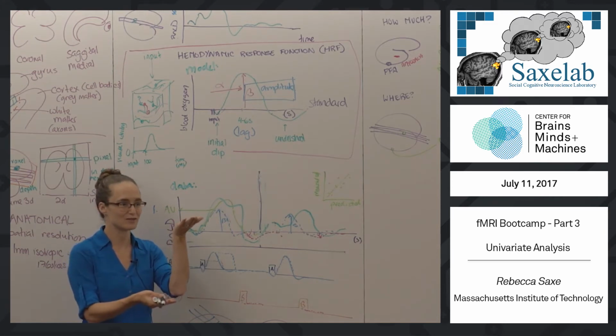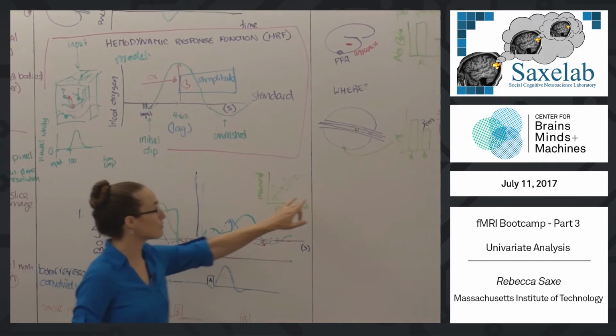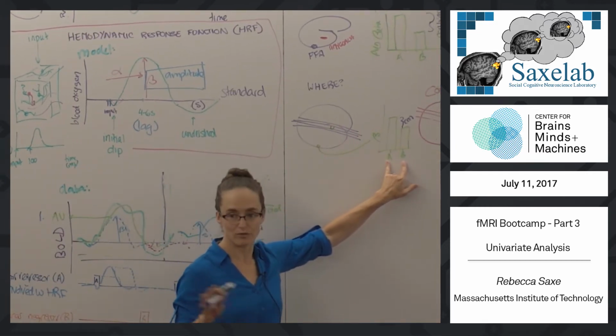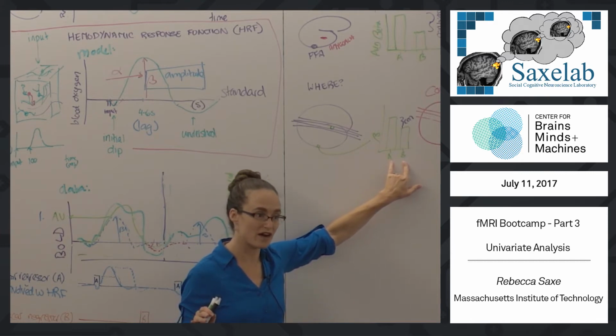The signal, the difference between conditions, how big is that relative to the noise in the thing I measured it in? And so now here, what we want to know is, we don't have any other participants. This is one person. We have one voxel, the beta for A, the beta for B.